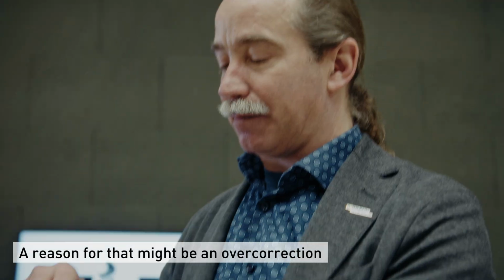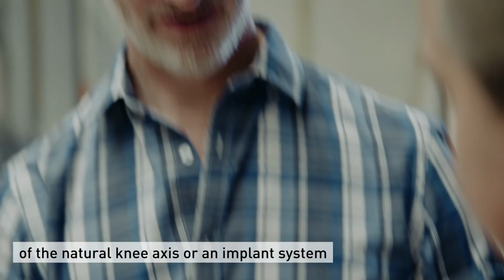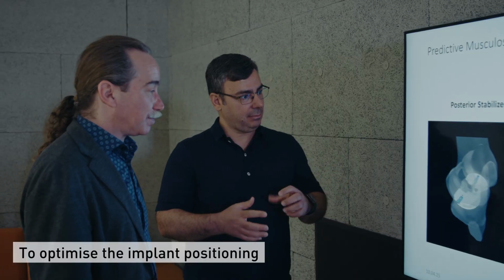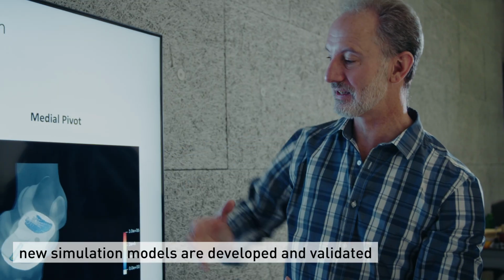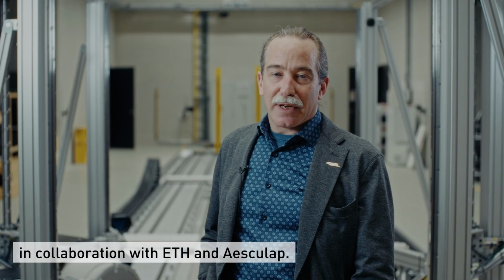A reason for that might be an overcorrection of the natural knee axis or an implant system that works against the natural kinematics of the patient. To optimize the implant positioning and choose the right implant design, new simulation models are developed and validated in a collaboration with the ETH and Aesculap.